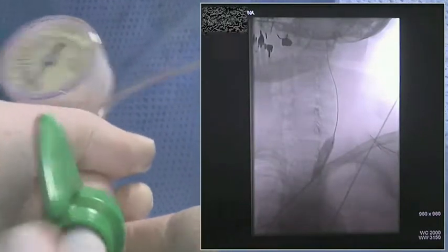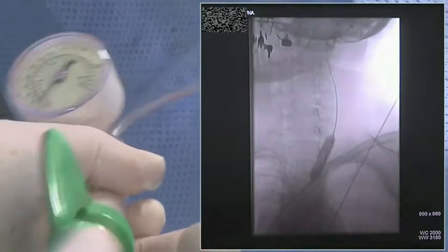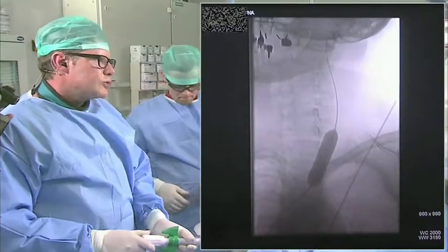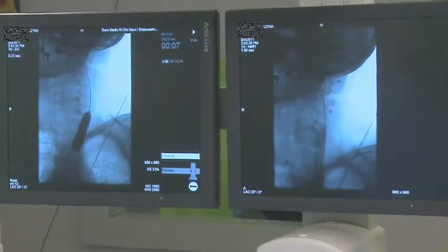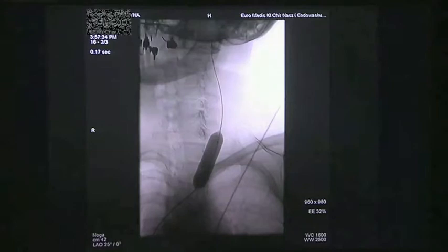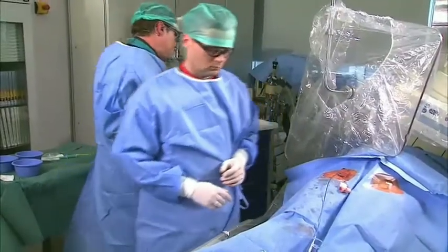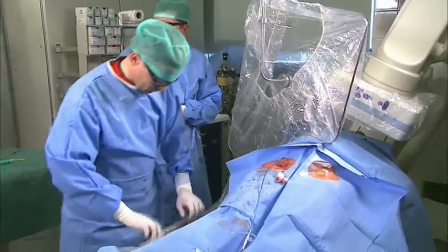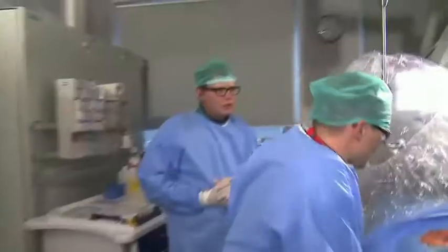We are making inflation with a 14mm balloon now. We have eight atmospheres now. We had the impression of a 12mm balloon before. The patient is feeling a little bit of compression on the left side, but it's painless.